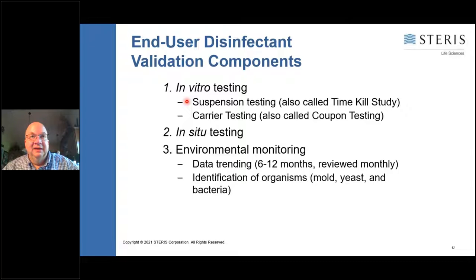And then another key component is the carrier or coupon testing. That would tell me, can I actually kill that bioburden on a hard surface that might be in the clean room, that is common in the clean room? That's something else you would want to know about.